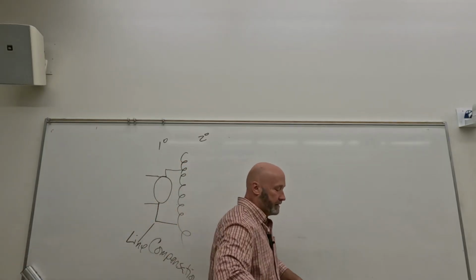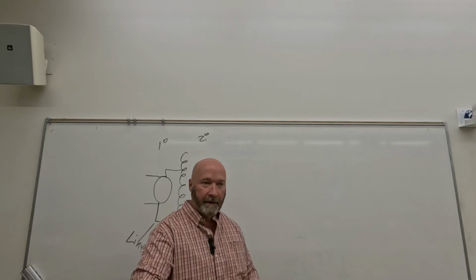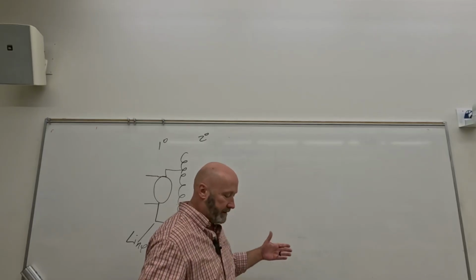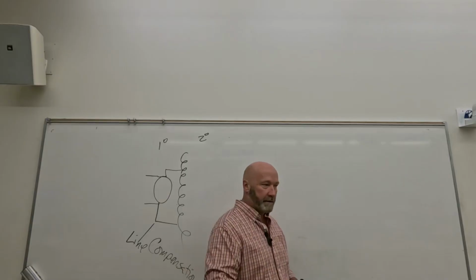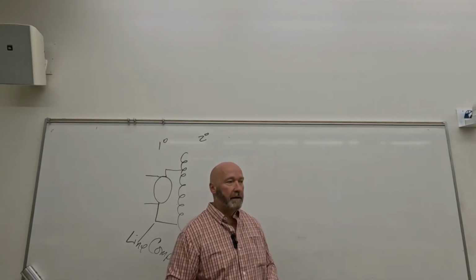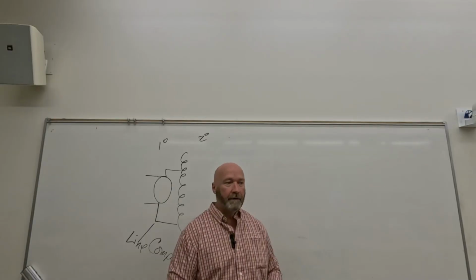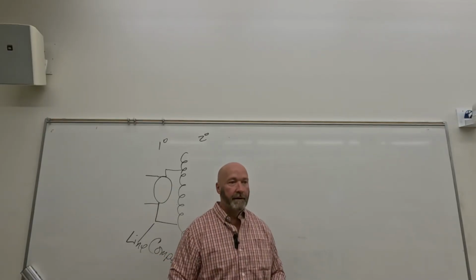But if the beam passes through something, it may pick up some signal and deposit it on the image receptor. So the cushions, those little thin cushions that are on the table, are also radiolucent. Also, if you're in a room where you deliver contrast, if the cushion gets any contrast on it at all, then that reflects an artifact on the image receptor.